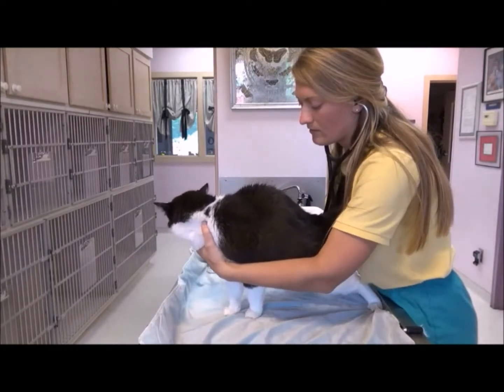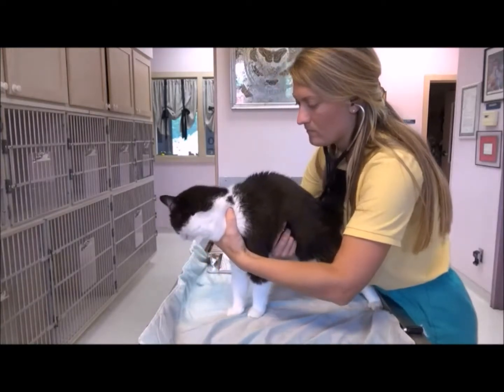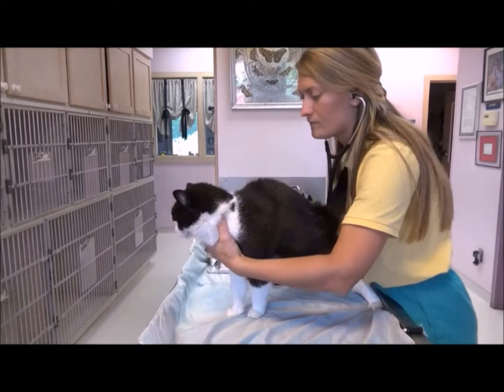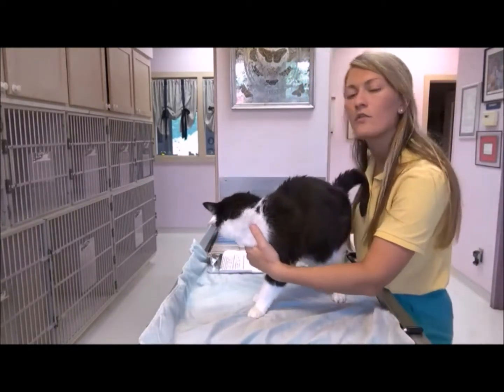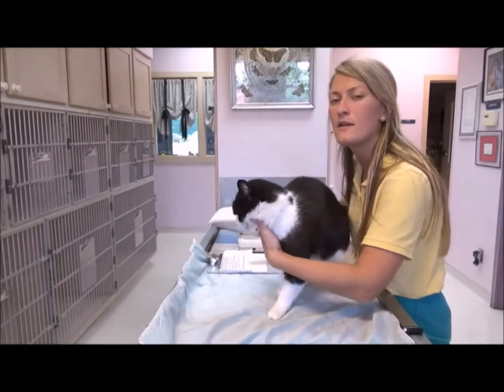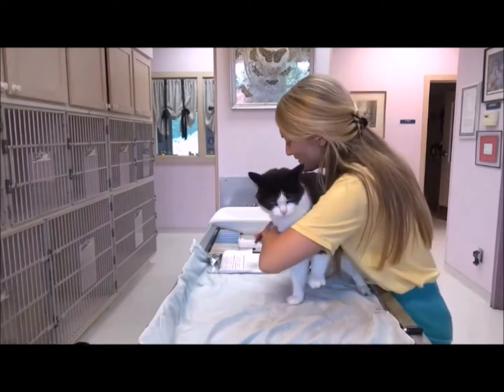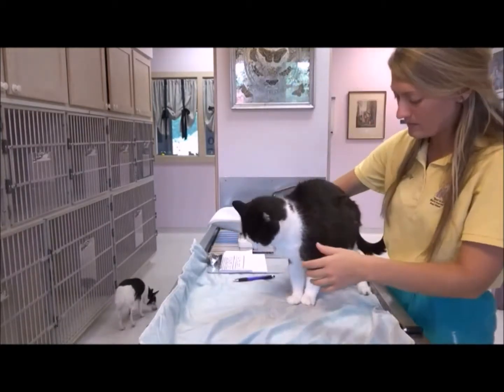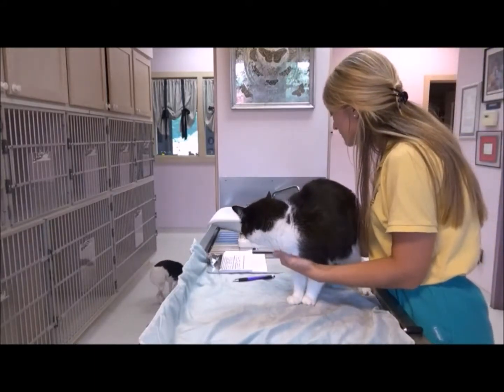I'm going to check out his lung sounds as well. Okay, the lungs sound good, the heart sounds good, strong beat. It's pretty rapid, about 200, so he's a little bit nervous. Make a note of that. We'll check out his respiration rate. Wait for my timer to reset.